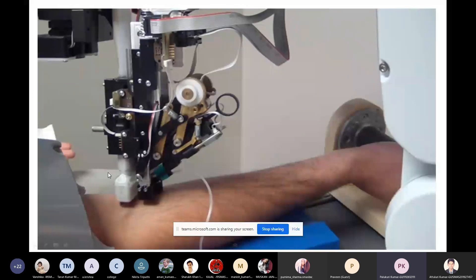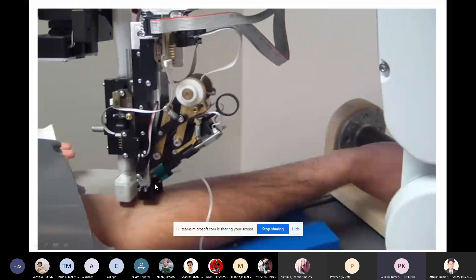When collecting blood manually, pulling the plunger too fast causes blood to hit the piston and results in hemolysis. With the robotic hand, the piston is pulled at a proper speed. Blood enters through a narrow tube first before entering the syringe, greatly reducing hemolysis. This robotic hand is used inside laboratories to collect blood samples.